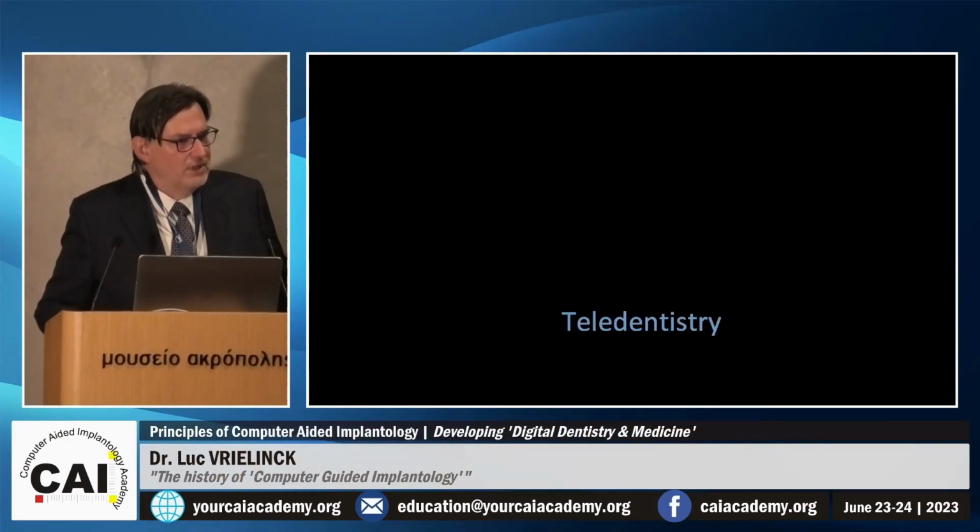Of course, don't forget teledentistry in our world. With Corona, it became very important to be able to work at a distance, to have radiographs for your planning, even to do a planning at a distance, prepare everything before the patient comes, and you can give them the explanation.